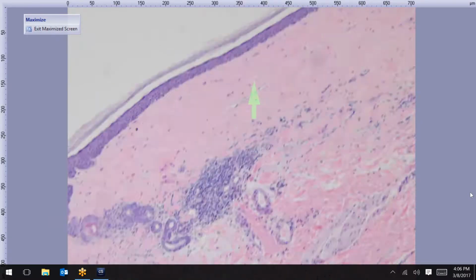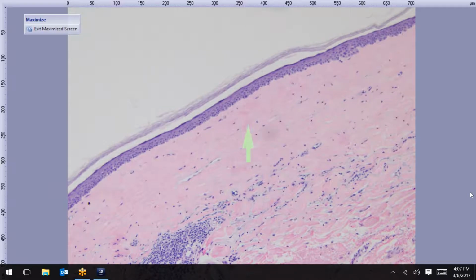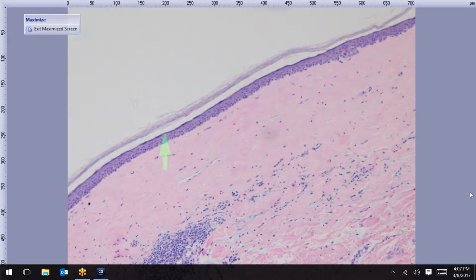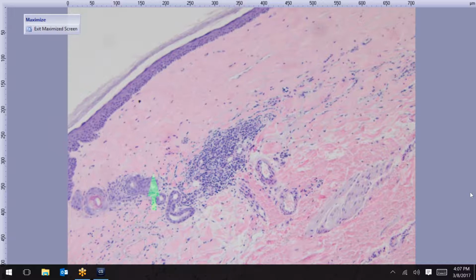We get the epidermal atrophy, and then in the upper portion, really the papillary dermis and a little beyond, you get this sclerotic band here, homogeneous. It almost looks like it's been painted on with a paintbrush. It's just so homogeneous and uniform, and just subjacent to that, you usually get this kind of band of lymphocytes. And then it kind of just stops.